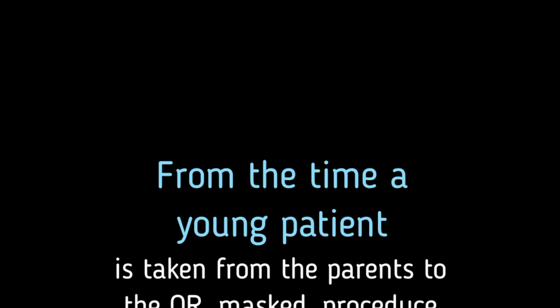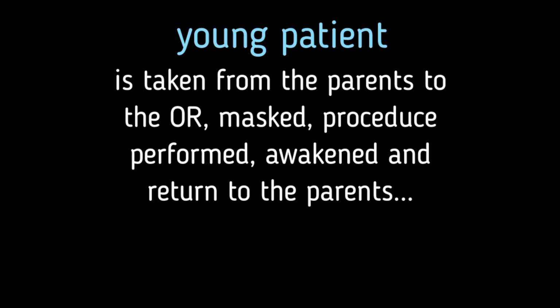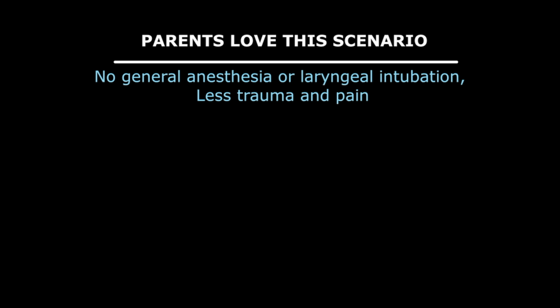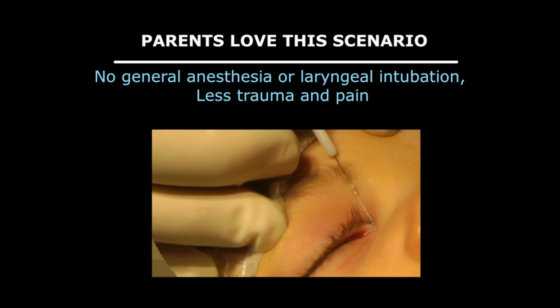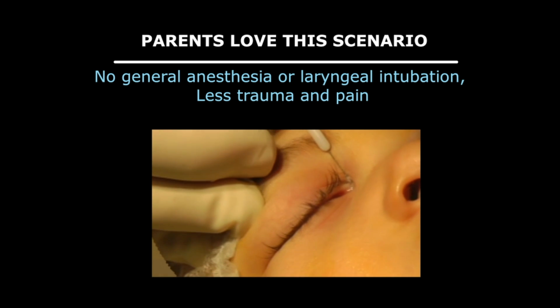It has been reported that from the time a young patient is taken from the parents to the OR, masked, procedure performed, patient awakened and returned to the parents, takes only about 15 to 20 minutes. Parents love this surgical scenario because the child is not under general anesthesia or even laryngeal intubation, which causes a sore throat, and there is less trauma and pain associated with insertion of the stent.